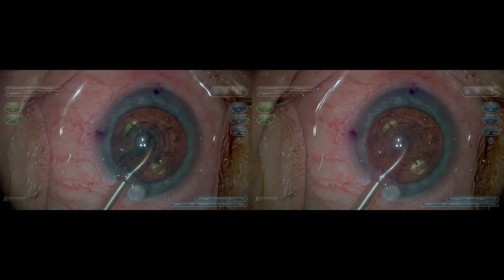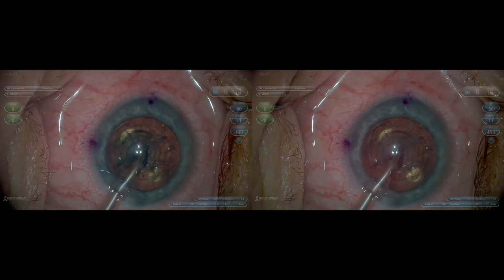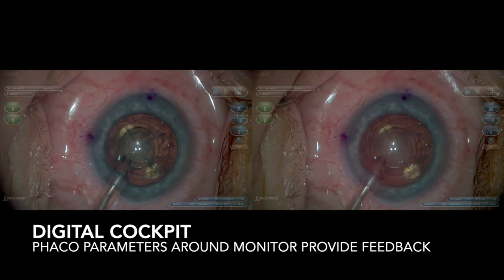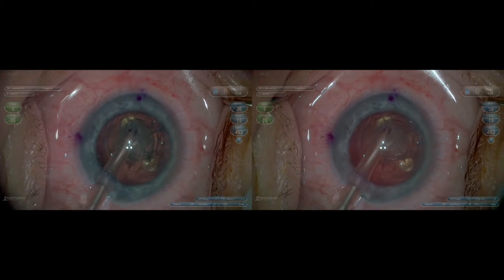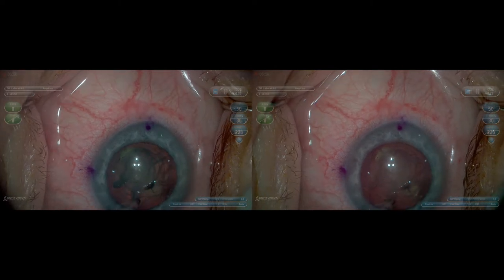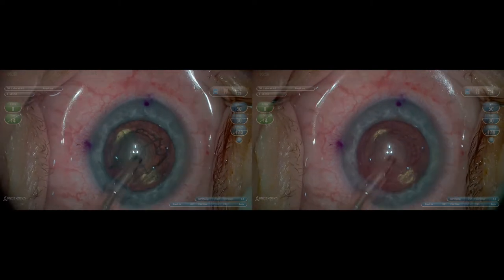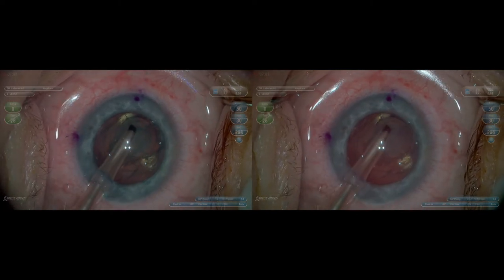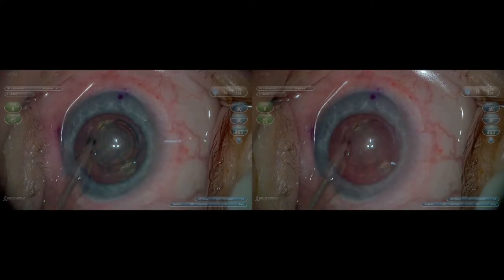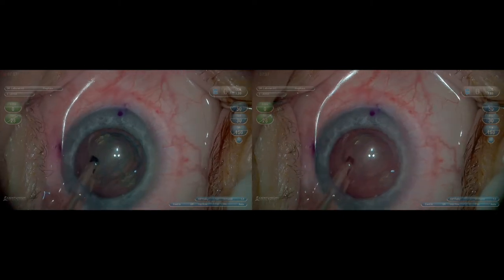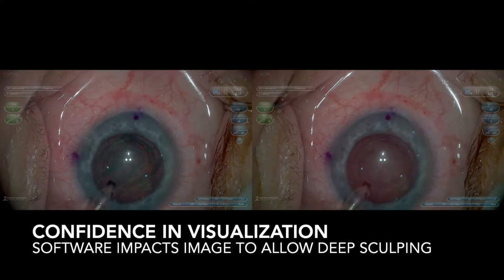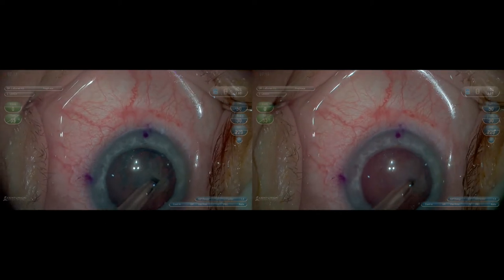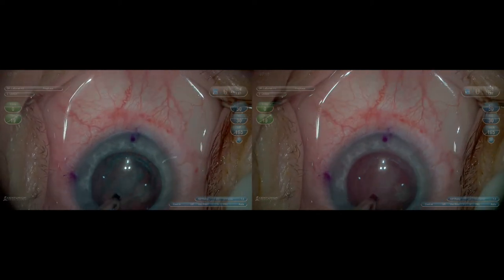So my next instrument into the eye is the FACO tip. Because the nuclear component was broken into 24 pieces, I just remove a central bowl. You can see there's a digital cockpit — I think this is really the tip of the iceberg with technology. While I'm operating, I can see my FACO settings, usage, and CDE as well. It gives me confidence in visualization, and the software is really doing a lot of work behind the scenes with the Ingenuity system.